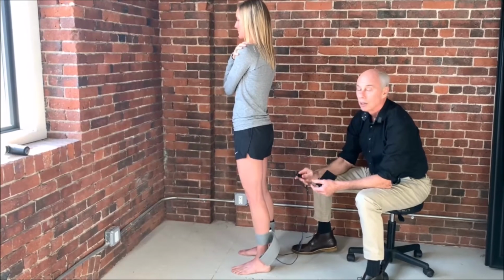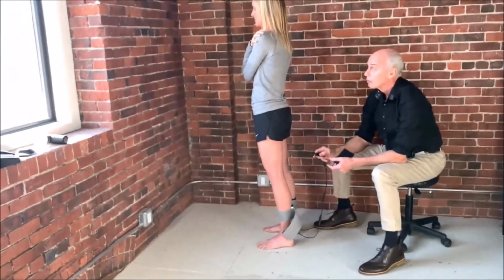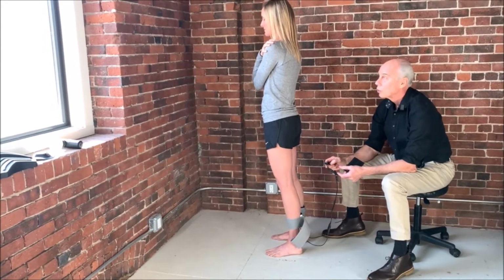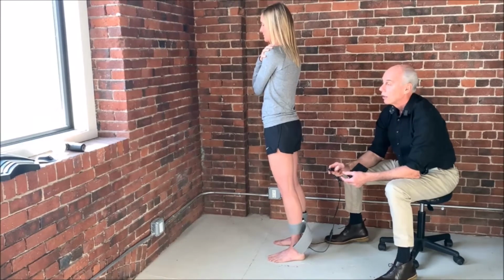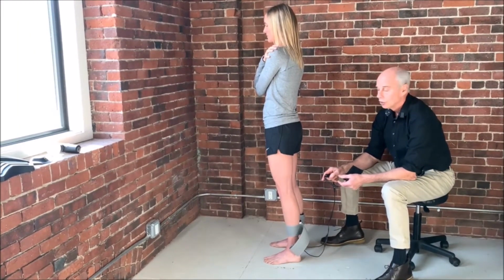And I don't tell people what to expect before I do it, but I do occasionally just turn it on and off like this, because you get a sense of how the core proprioceptors are responding to the impaired information from the soleus. Super easy to do.